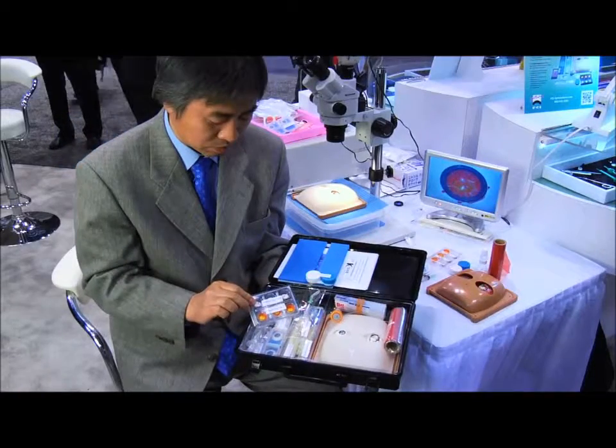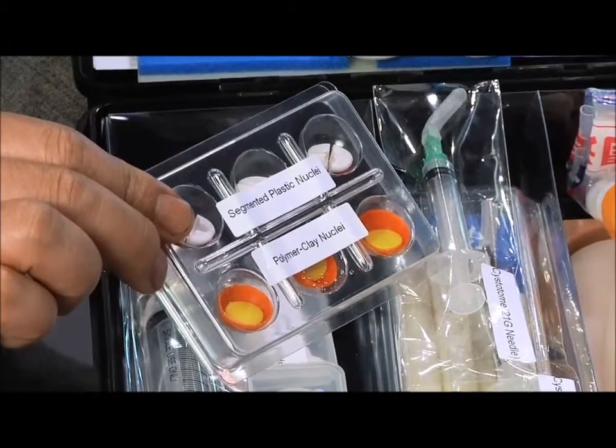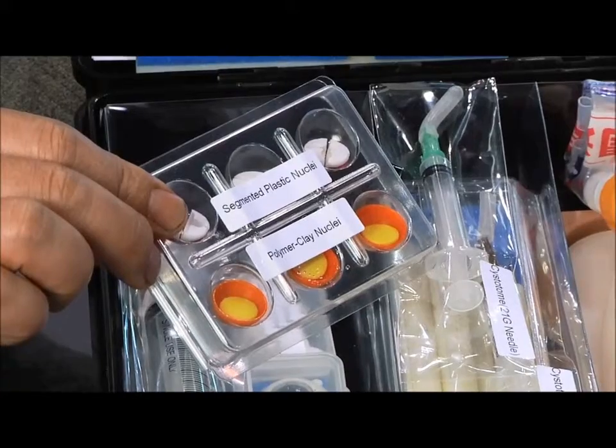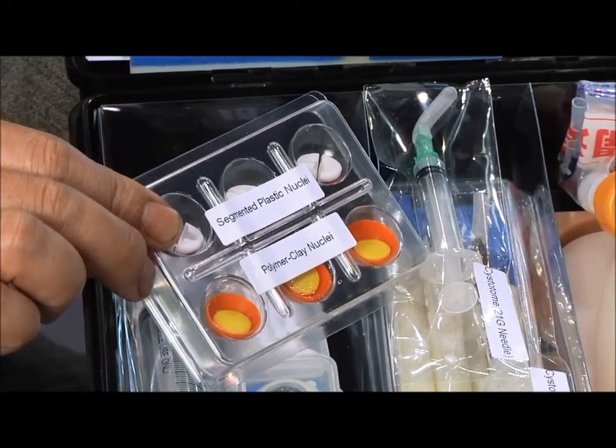Also in the kit are segmented plastic nuclei along with polymer clay nuclei. These are used to practice basic instrumentation and nuclear segmentation techniques like divide and conquer, stop and chop, and phaco chop.